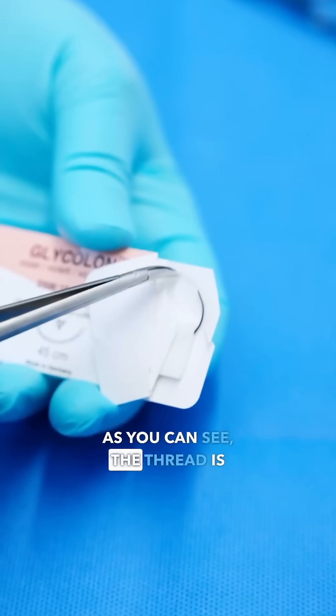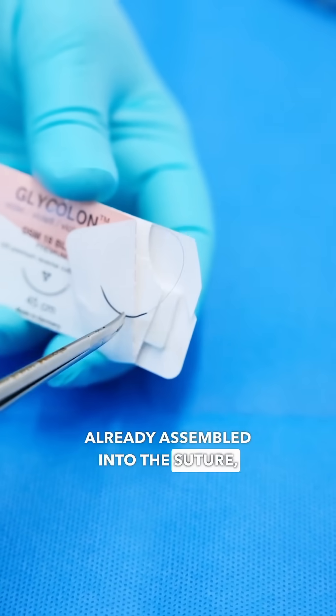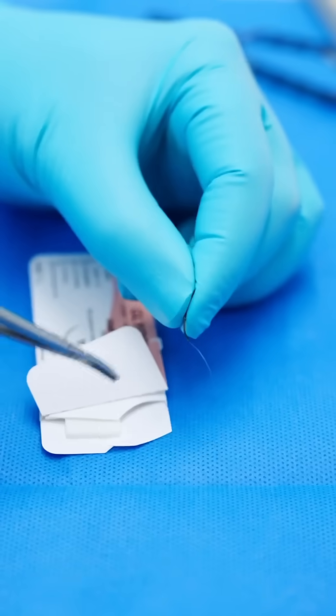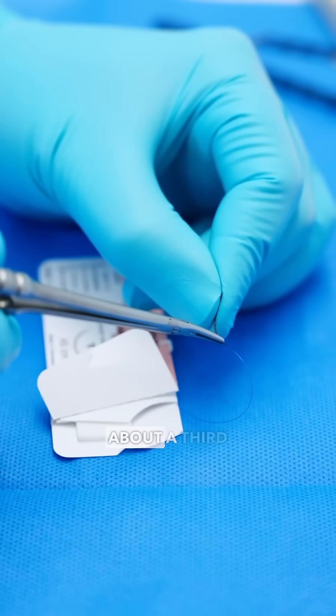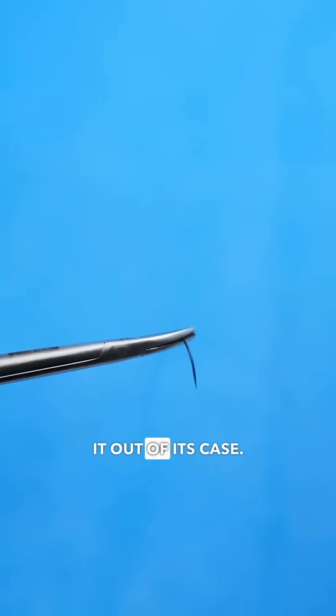As you can see, the thread is already assembled into the suture, so we don't need to be threading the needle. We grab the suture material about a third away from the hub of the suture and then pull it out of its case.